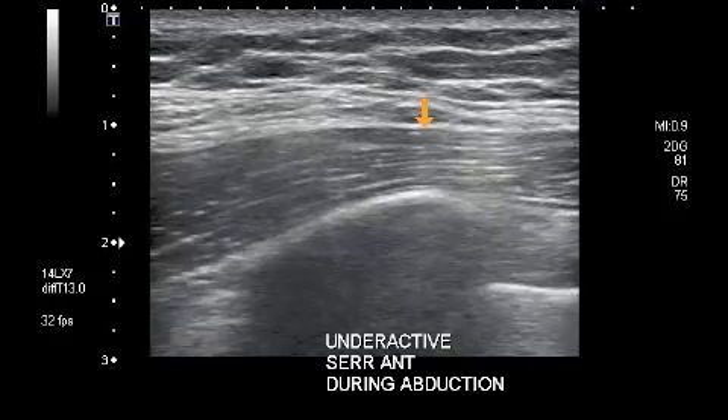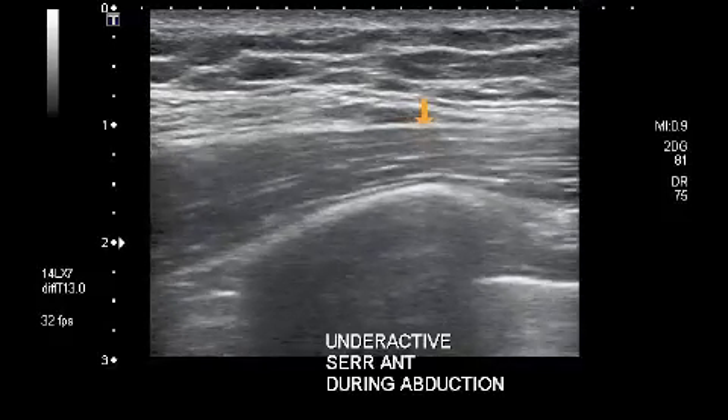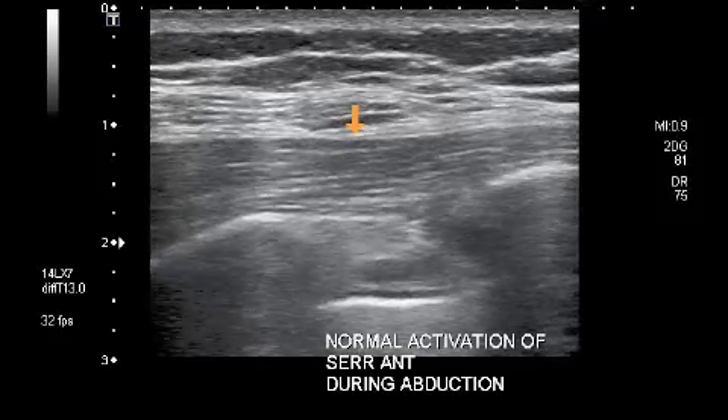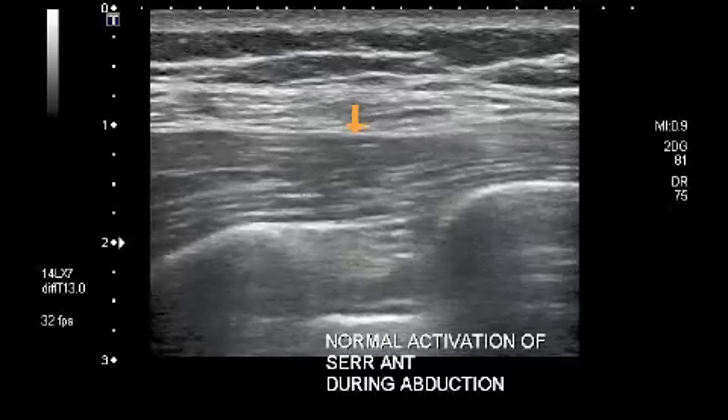Again, if underactive, this is associated with scapular winging. Improved activation should then be targeted with the rehabilitation program.